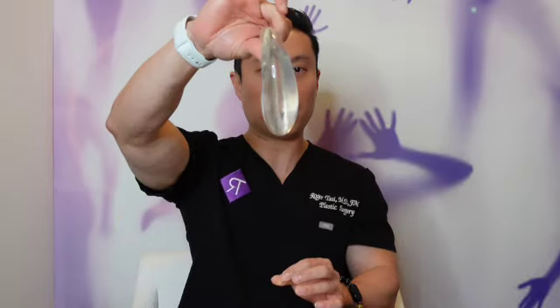In my practice, I generally stick with 3 different types of profiles. The low plus, the moderate, and the high or full profile implant. So the low plus profile implant, you can see it's very flat, it's very soft and very natural. I do these on patients who are skinny, thin patients who want just a little bit of oomph, probably about 1 cup, 1.5 cups.